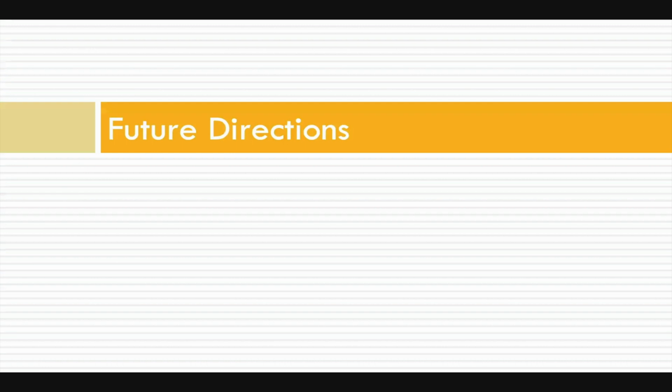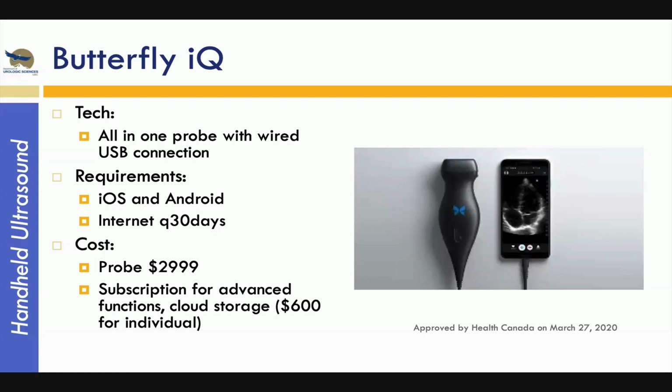So with all that, ultrasound has a lot of potential, and a lot of it is based on quite fancy equipment that you wouldn't necessarily be able to get at every center. But I wanted to quickly talk about some handheld devices that people could use in clinic. I think our clinic was looking at one of these 2 devices. I'm not sure which one we landed on, but there are 3 main ones on the market.